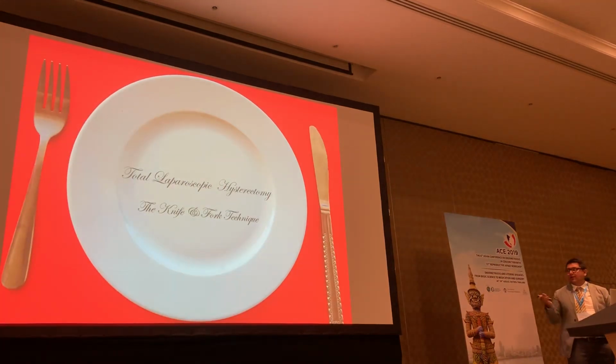And we're going to come to a very basic topic. Total laparoscopic hysterectomy and the knife and fork technique. And I say a knife and fork technique because we use reusable instruments. It teaches you to use both your hands.